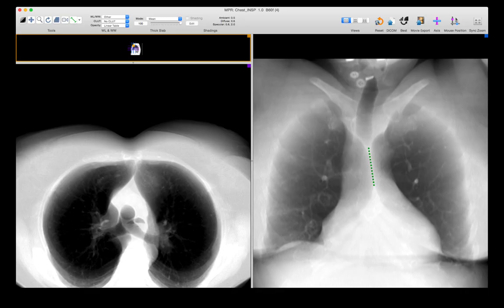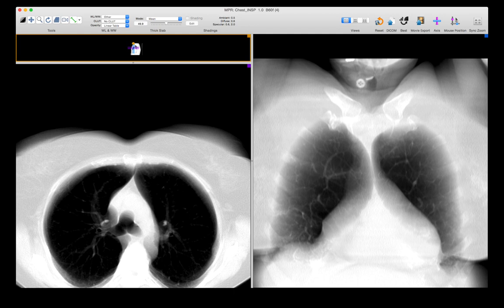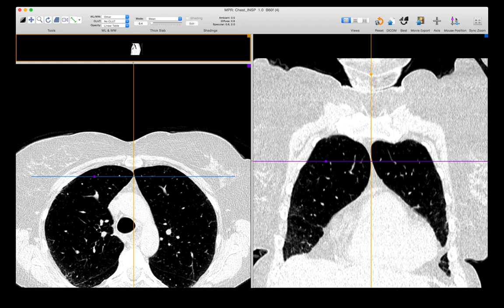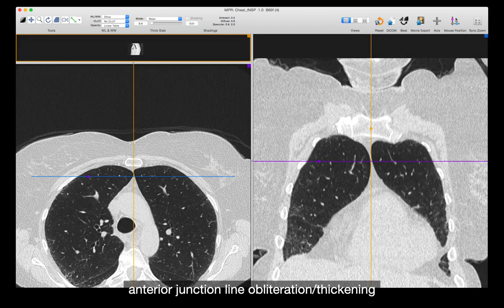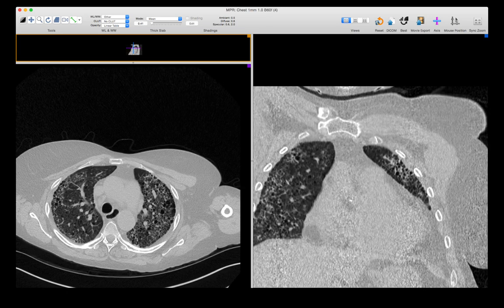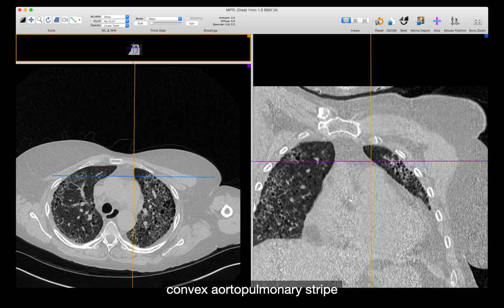There are one or two more sensitive imaging features on chest x-ray that work on rare occasions but require the anterior mediastinal mass to be exactly in the right spot. The anterior junction line, something we see often in folks with hyperinflated lungs like those with COPD — if you have an anterior mediastinal mass, you might recognize the anterior junction line is focally obliterated or focally thickened.